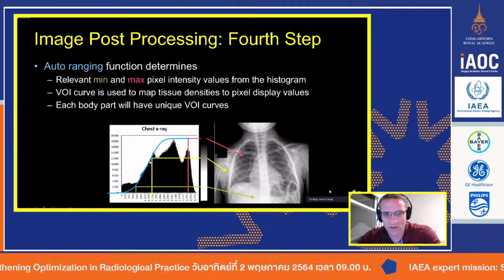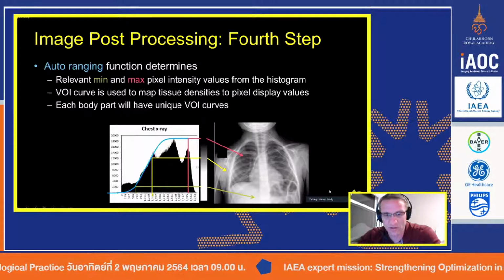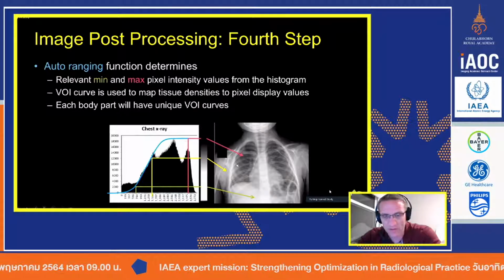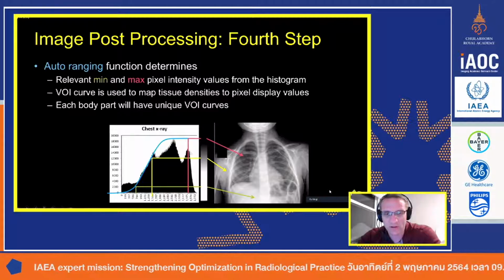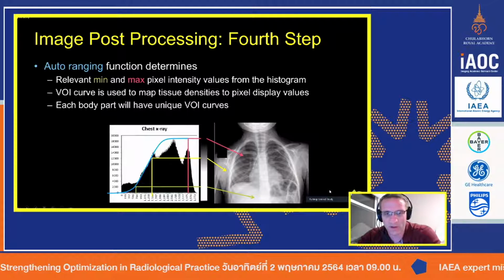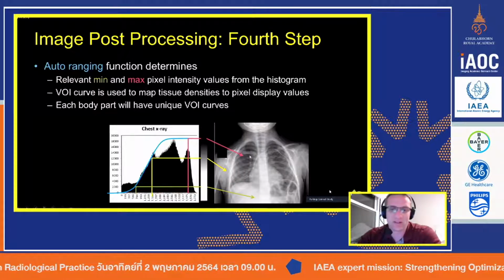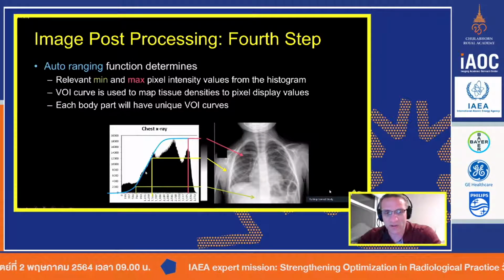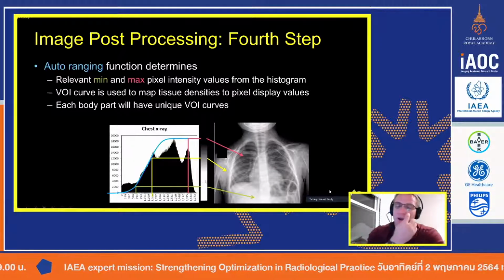Over here, the lungs, or right here in this region, are going to look somewhere in this little bit lighter region. And then some of the values up here are probably more like your ribs, and this is more like your lungs, and the lungs can be a little bit blacker. I said that backwards. But nonetheless, my point is that each value along this histogram is going to be mapped to a different gray and white scale.